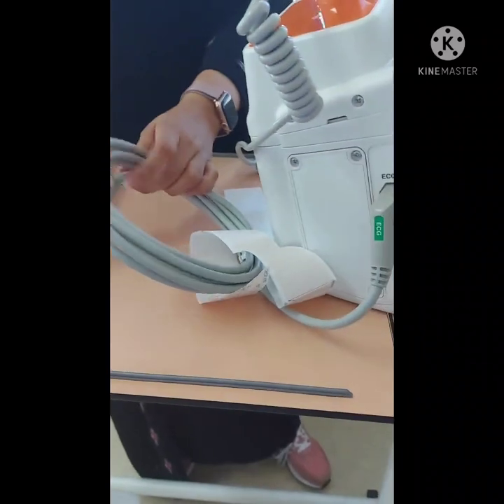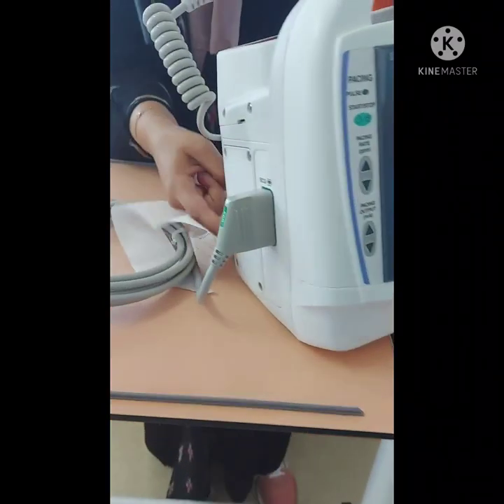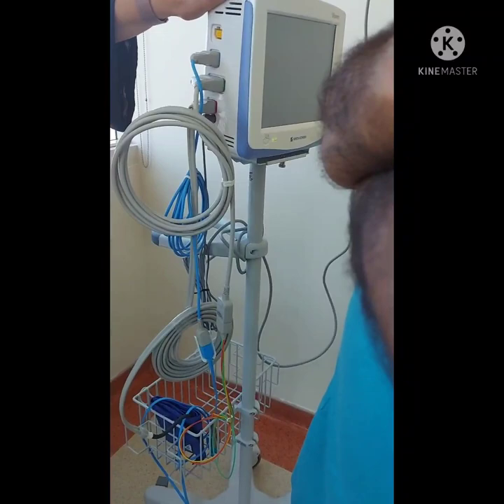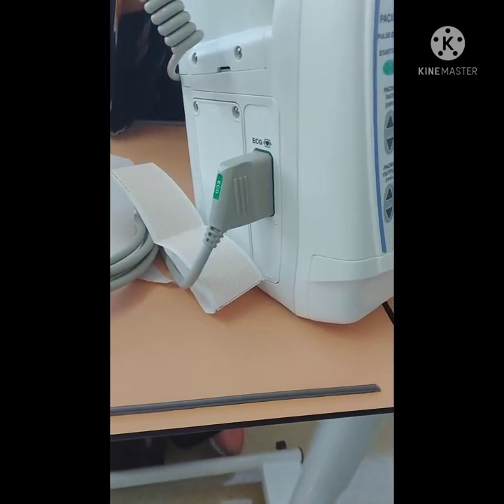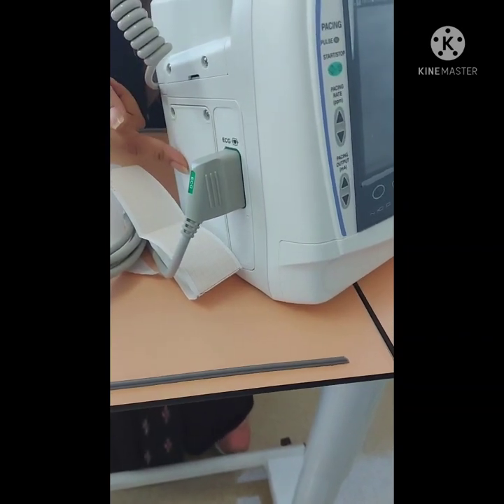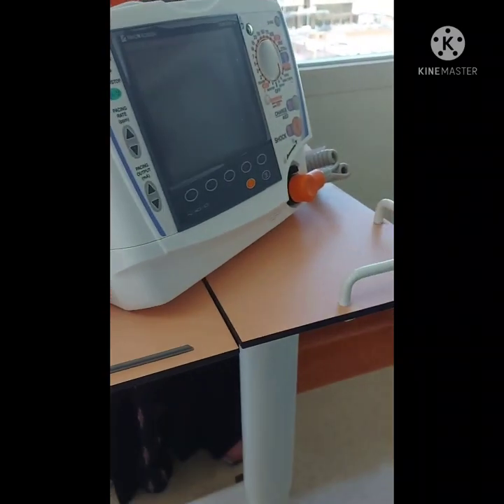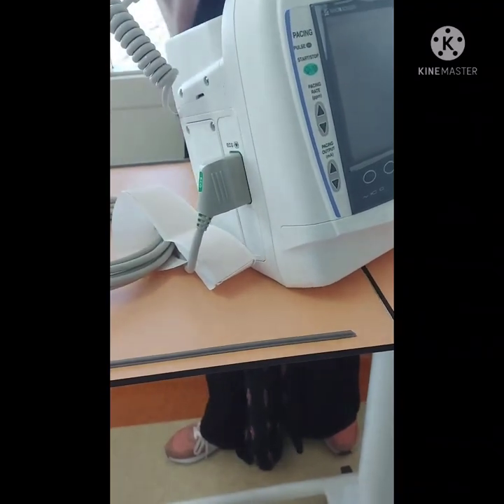And you will see it also in the monitor, it has a manual guide. For here, there is nothing right now, but next week, you will have an SpO2 port, like this one, exactly, with the adapter itself. You will attach it there. This part is going to be opened, because they requested it with the SpO2, but we don't have the module in Khobar, so they are bringing the module from Jeddah, and they will install it here. So it's going to be with an SpO2 also. So ECG and SpO2. In the future, you can add also CO2 if you want. The ports will be there, but you just have to purchase the adapter itself.